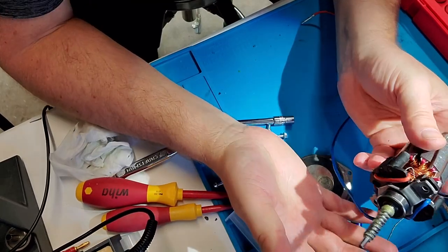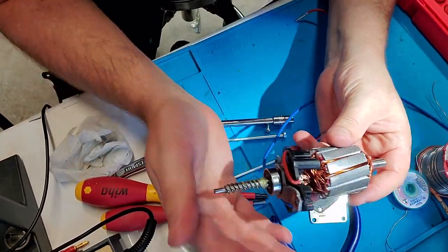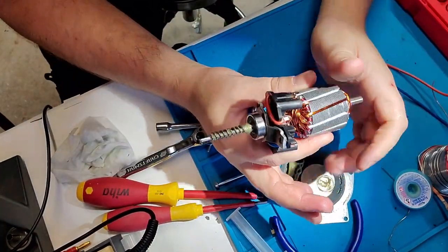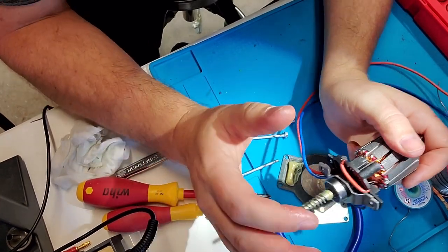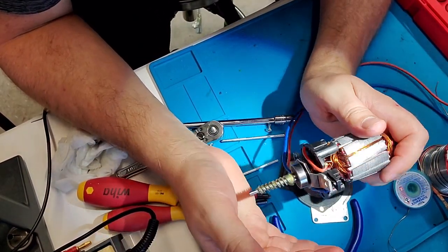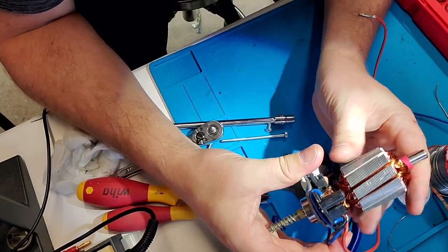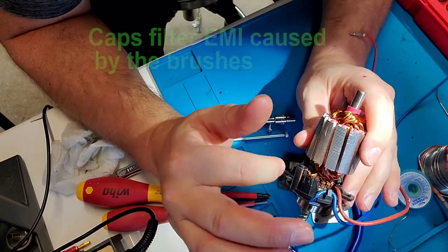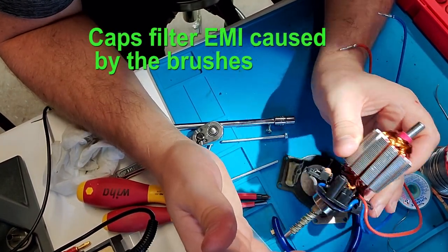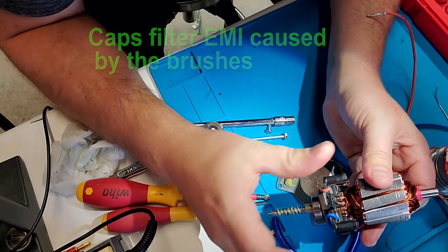And like I said, this motor is a low duty cycle part. It gets very low wear and tear. And the fact that Biomed's changed these parts out for little to no reason. I mean, this guy here, it was ordered, so I changed it out anyway, but it wasn't really necessary. So you have capacitors here, and then you've got a large inductor right here. Both of those help filter out some of the noise. Brushes create noise, all right?